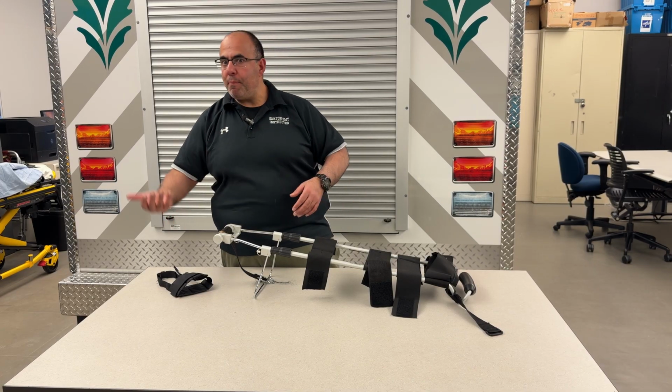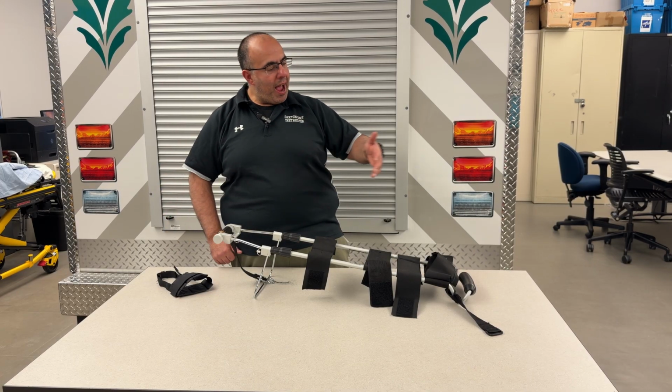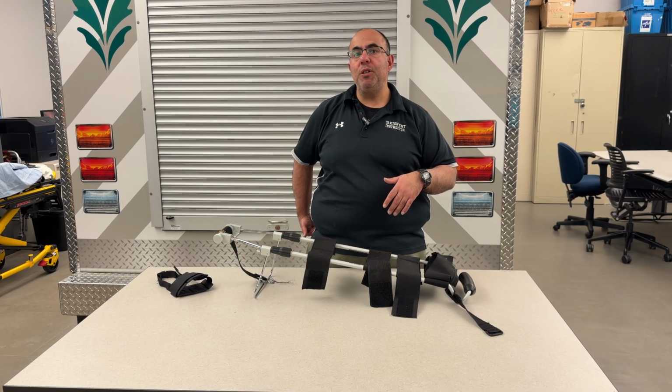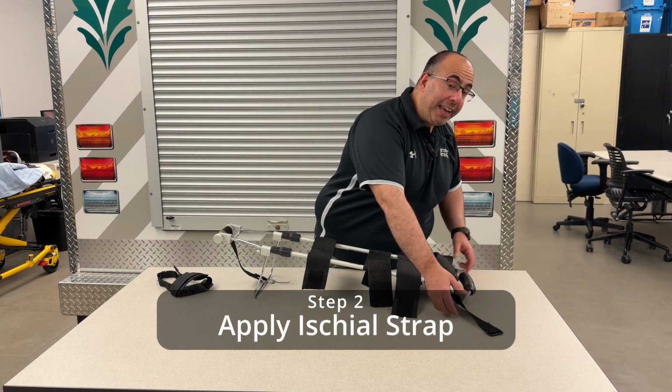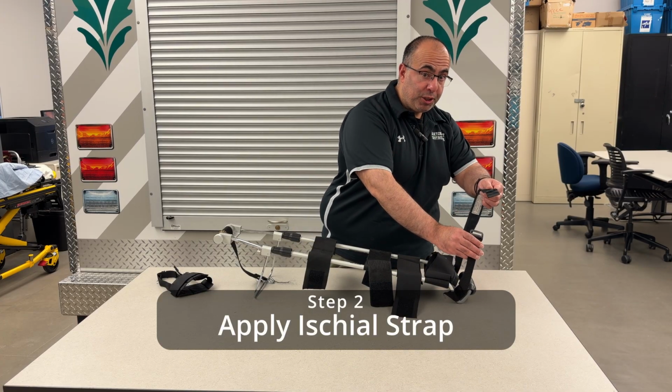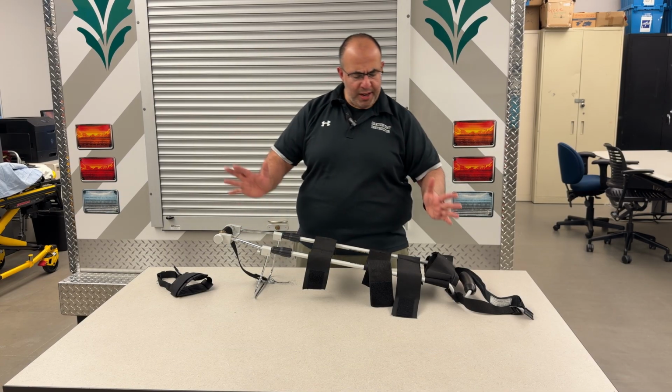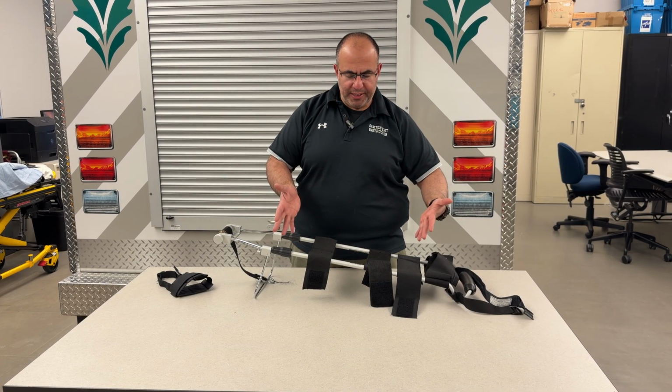Now we've measured it. My partner is holding manual traction. I insert this on the injured side, right all the way up to the buttocks. I apply the ischial strap, which is your first strap to your patient, and then I apply that mechanical traction. Now we look at the actual device itself.